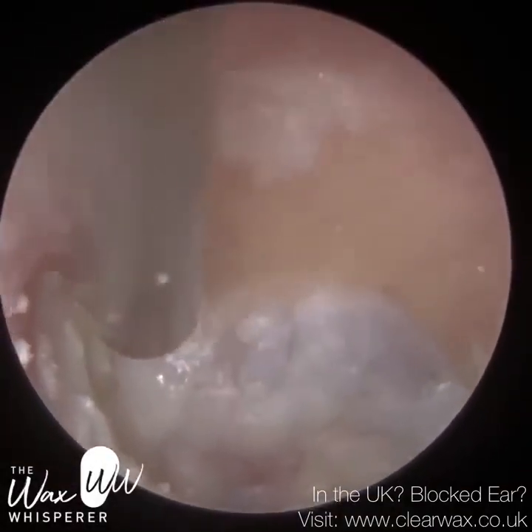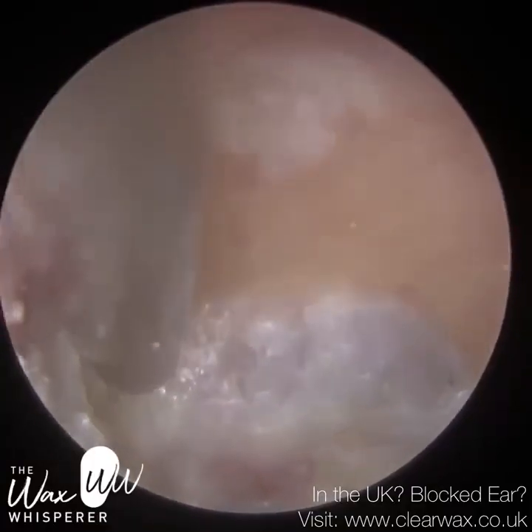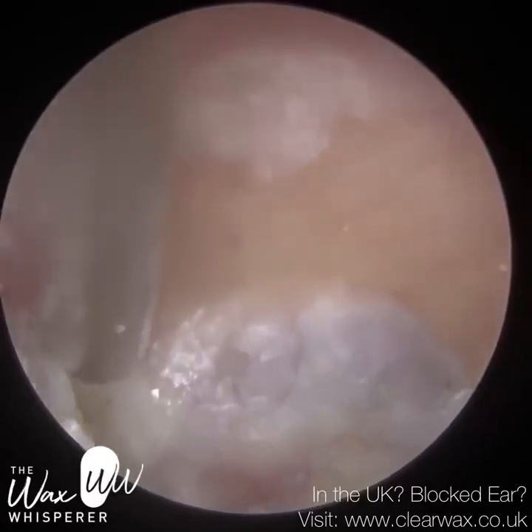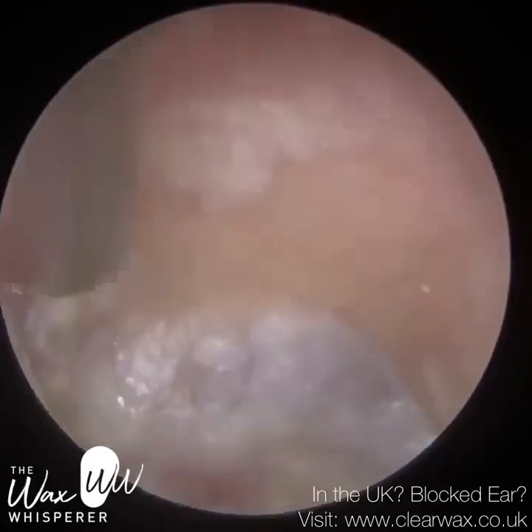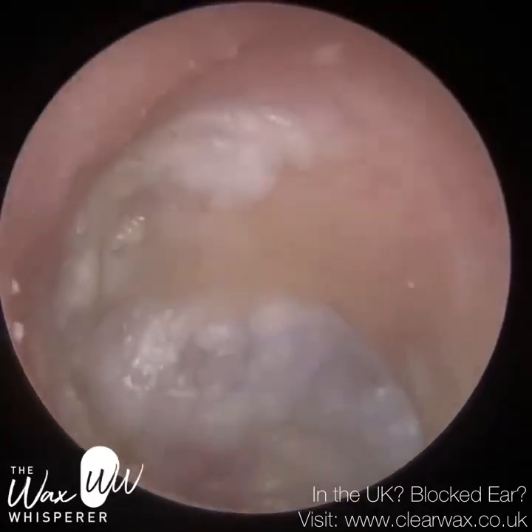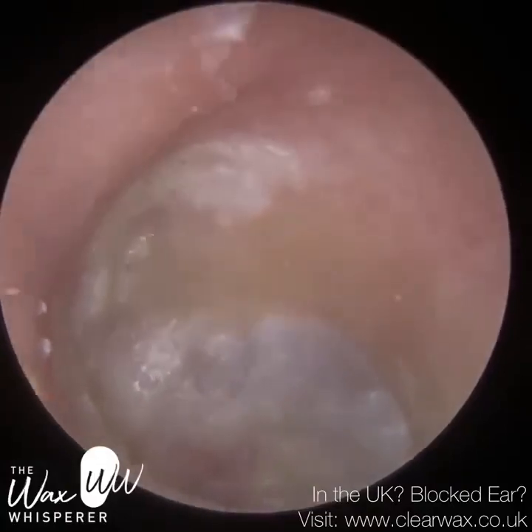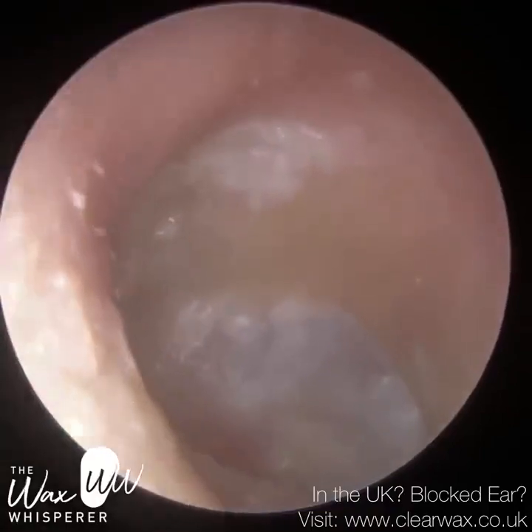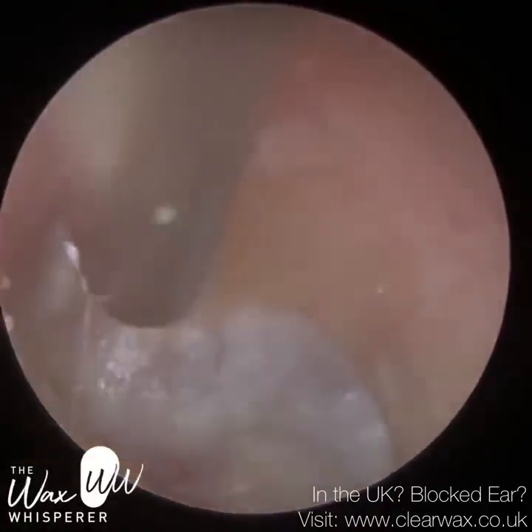So I'm just going to the top part of the ear canal now. I'm just trying to remove as much debris as I can. The patient was comfortable, and when you've got an infection like this, the more debris you can remove, the better it'll be. Never going to be perfect. We're not going to get rid of that speck. I'm trying to go up into the canal wall. You can see there's still a bit of swelling there in the midsection. The ear canal is a bit swollen.